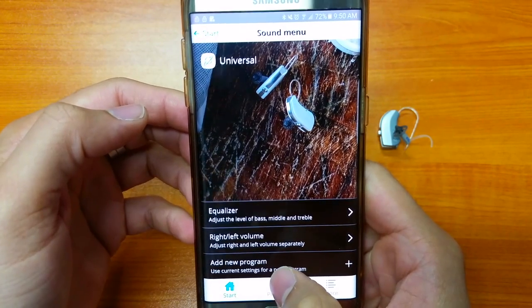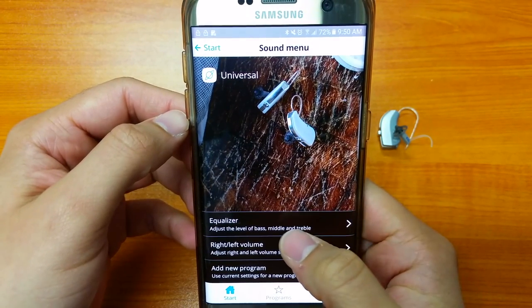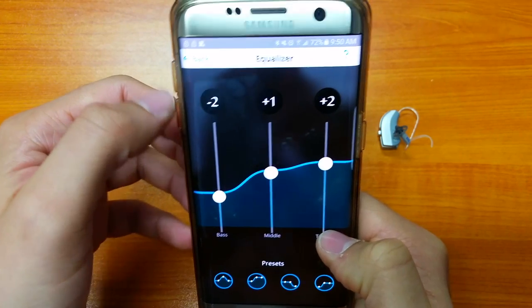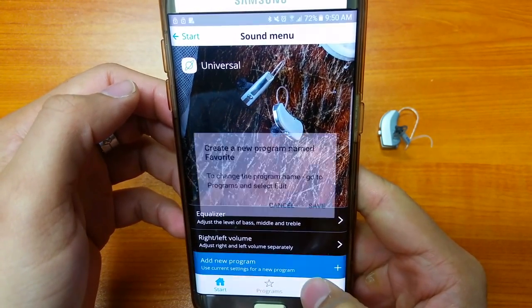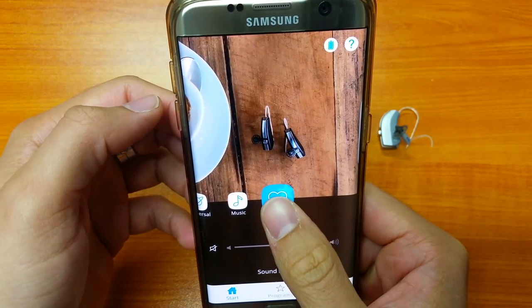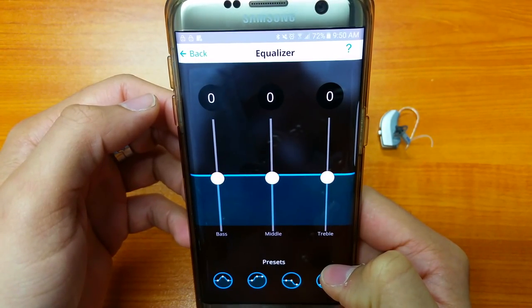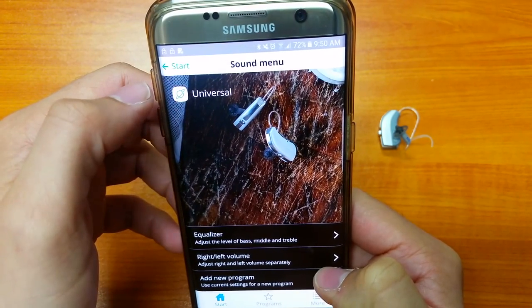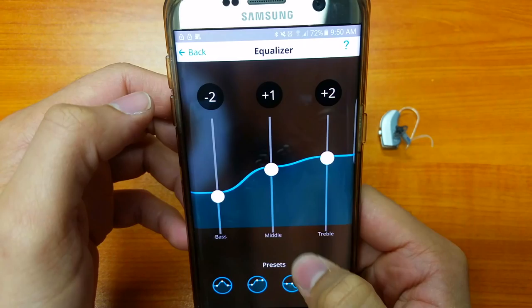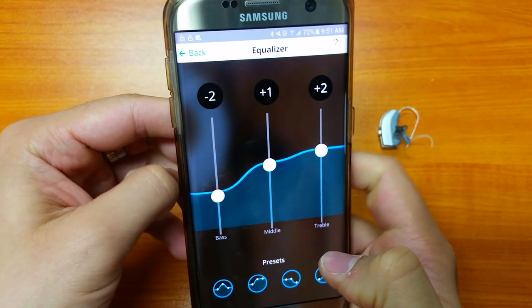Another feature is 'Add New Program.' For example, if you go out regularly and find in a noisy environment you're not getting as much high pitch as you'd like, you can create a program that gives you more high frequency. Go back, add a new program, select save, and you've just created a favorite program. Switching to Universal shows a flat equalizer response, but switching to the new program shows more high frequency — so you can create your own custom program for more control.